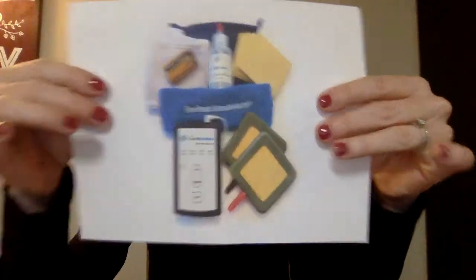If the electrode sponges aren't thoroughly soaked in saline, it could just cause some discomfort for the client. So you want to make sure that you get those properly soaked. And then to start your session, you would turn on this box by pushing the up button. It turns it on to 0.5 milliamps. For my example, like I said, it's going to be 1.0. So I would slowly increase to 1.0 milliamps by waiting every 15 to 30 seconds before increasing to the next number. Again, that's for your patient's comfortability.